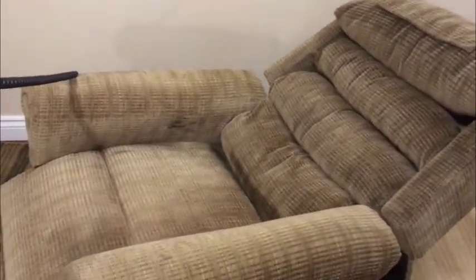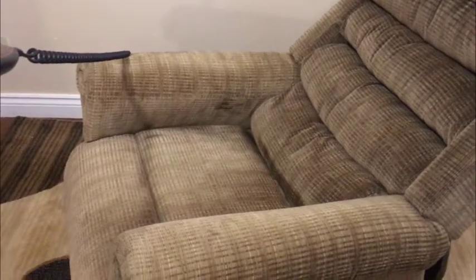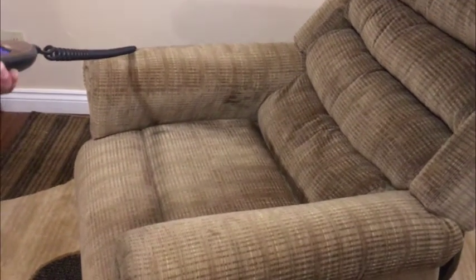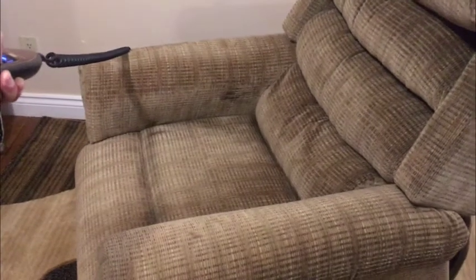Again, it's hard for me to use the control and operate it at the same time. But basically the motors just work in tandem to bring your rider up into a comfortable position.